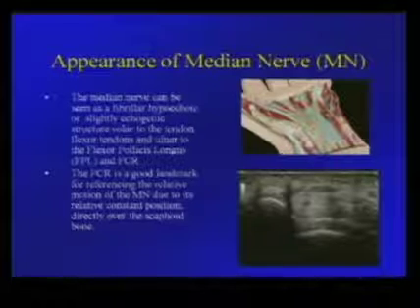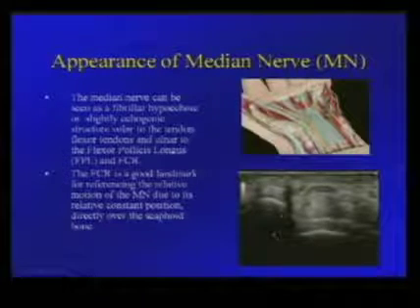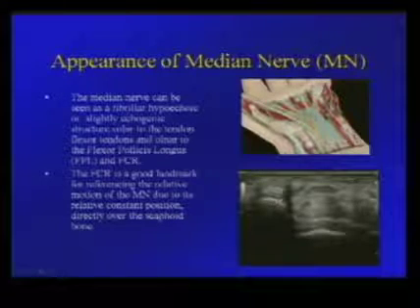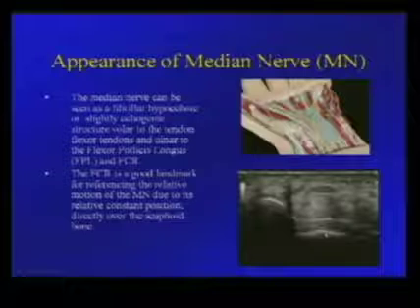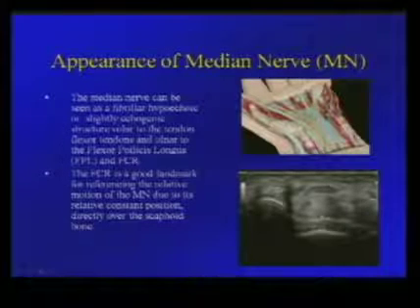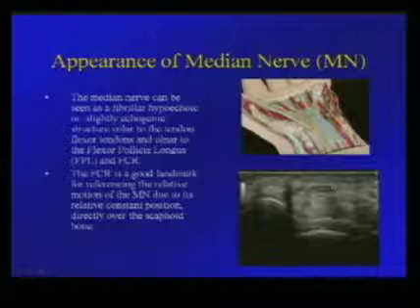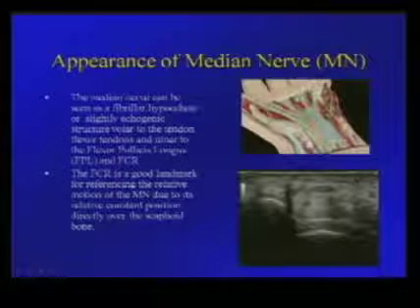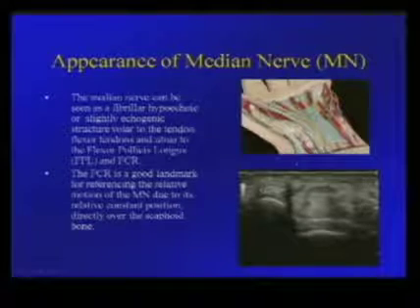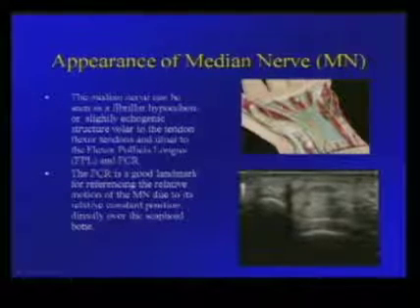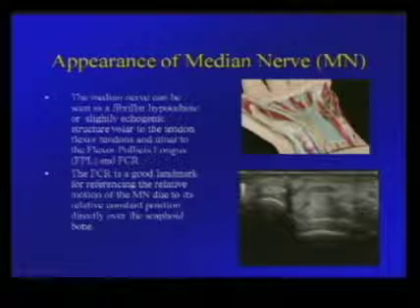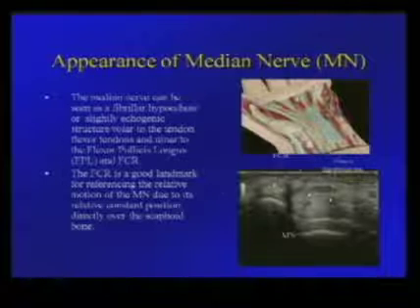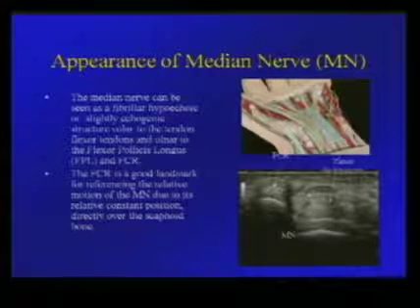Looking at the ultrasound cross-section through the carpal tunnel: on the radial side is the scaphoid bone, then the capitate bone. Over the capitate in the volar soft tissues is the flat structure of the median nerve. The flexor carpi radialis sits outside the carpal tunnel and serves as a good constant reference point for the location of the median nerve. The flexor digitorum is also shown relative to the median nerve and flexor carpi radialis.